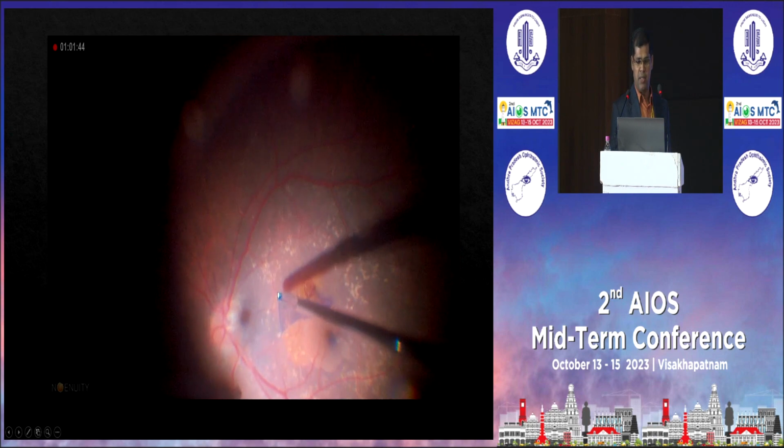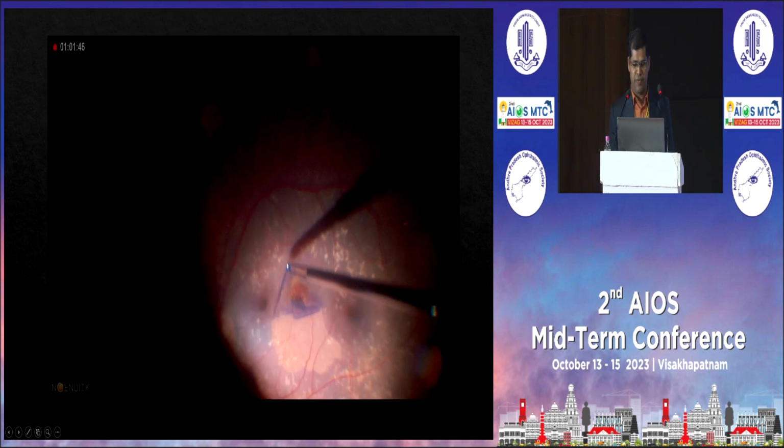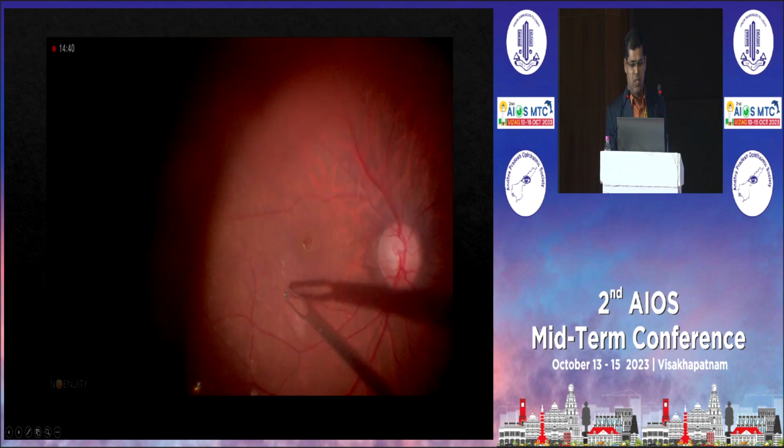In this, I most commonly prefer the inverted ILM flap technique, do a fluid air exchange and tamponade with 12 to 14% C3F8 gas.